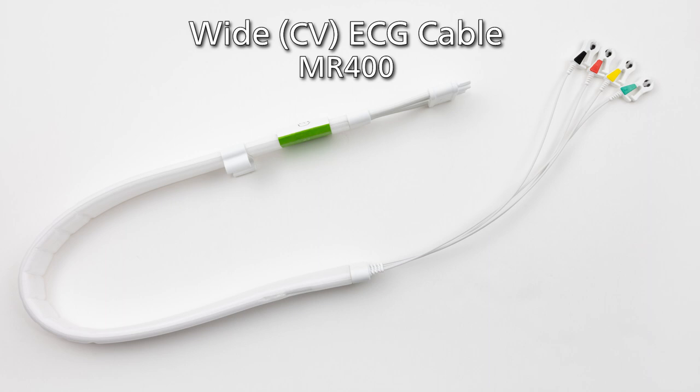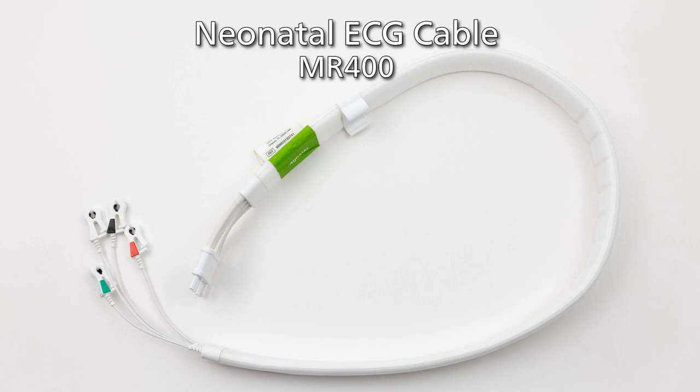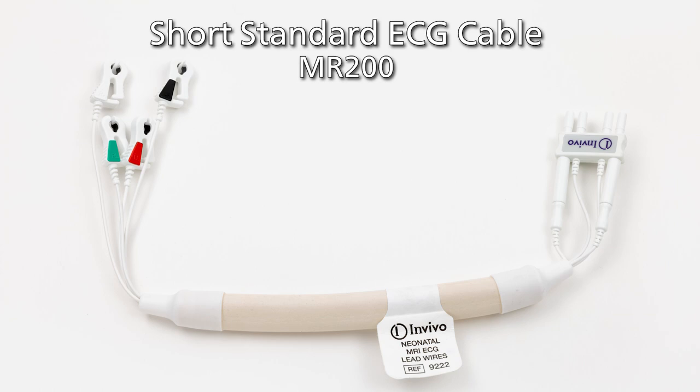The wide ECG cable, also known as the CV ECG cable, is designed for patients weighing more than 22 pounds or 10 kilograms and is best for female and overweight patients where placement would be difficult using the single patch electrode. The wide ECG cable should be used with the multiple patch ECG electrodes, also known as the CV electrodes, which are the electrodes that are separate. The neonatal ECG cable is designed for infants weighing less than 10 kilograms and should be used with the neonatal electrode. For the MR200, there are five types of ECG cables.